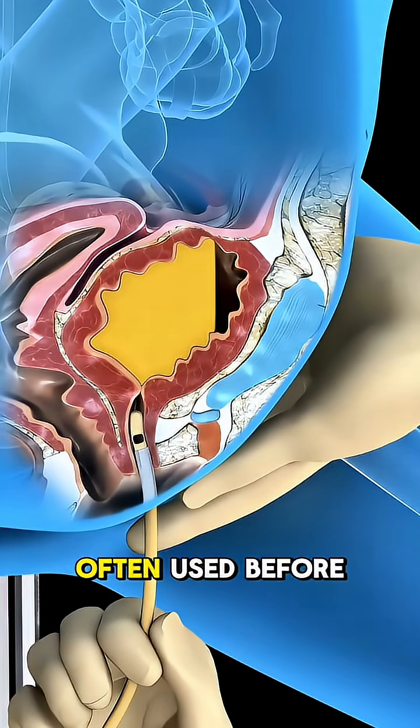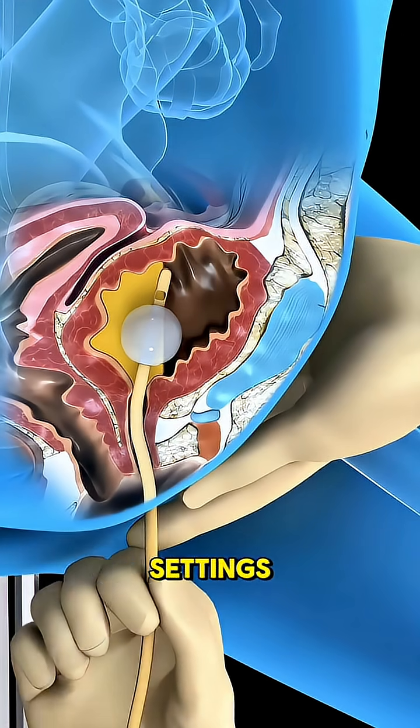Foley catheters are often used before surgery, in critical care settings, or for patients who are unable to urinate on their own.